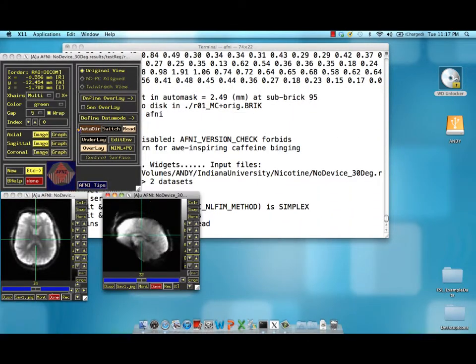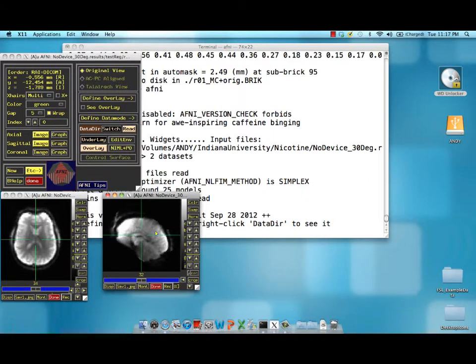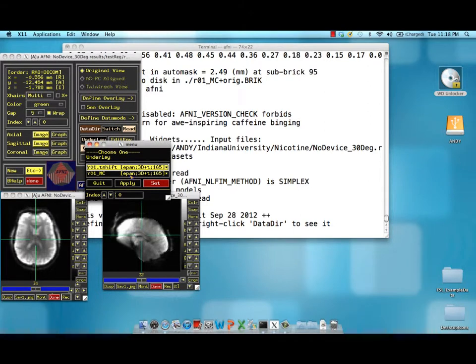I'm going to open up AFNI here to show you the difference between the slice time corrected data set, the one that was not altered in any spatial interpolation. This is going to be r01.tshift.